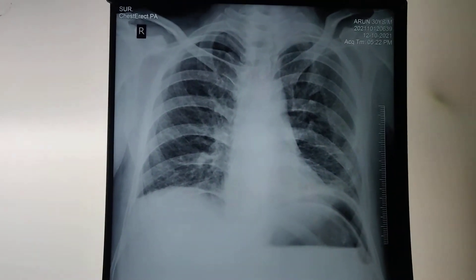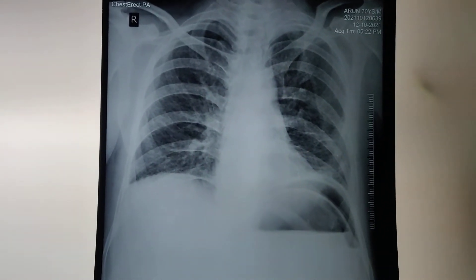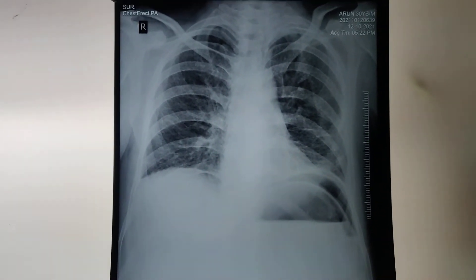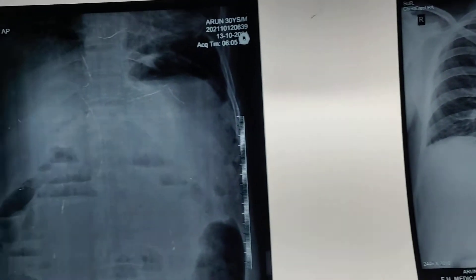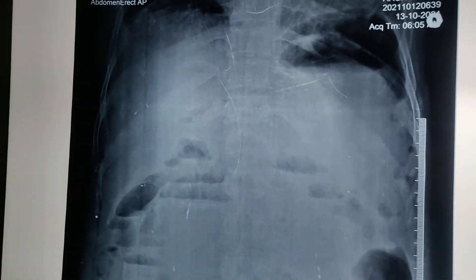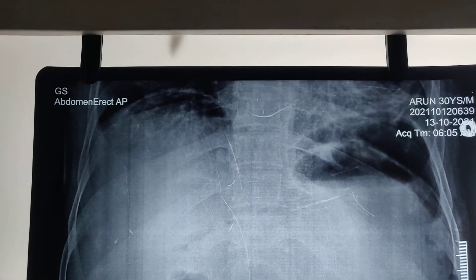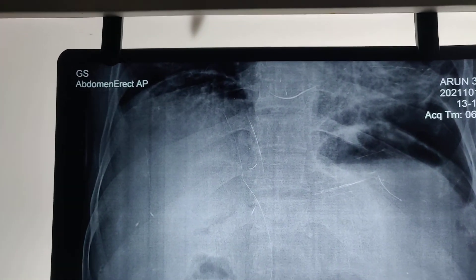This is the erect chest X-ray, and this is the image of the erect abdomen X-ray.